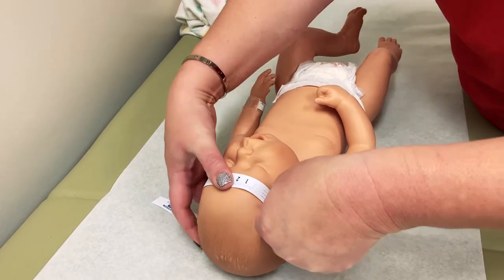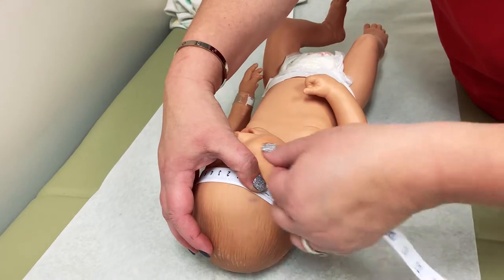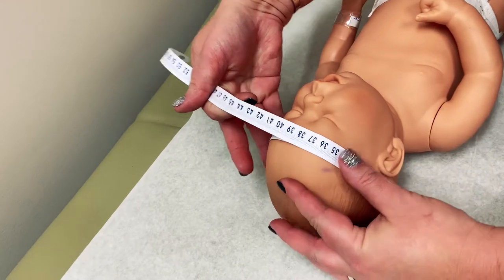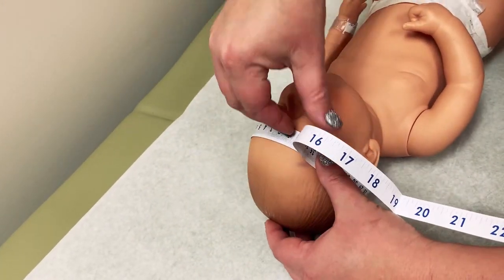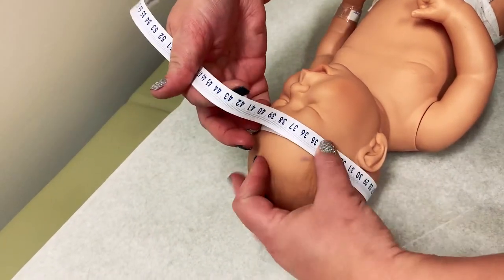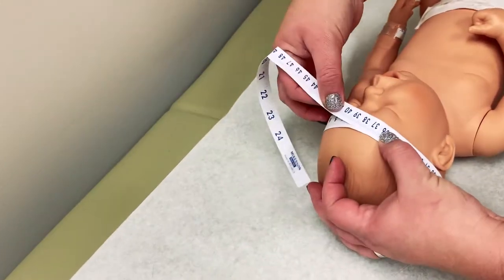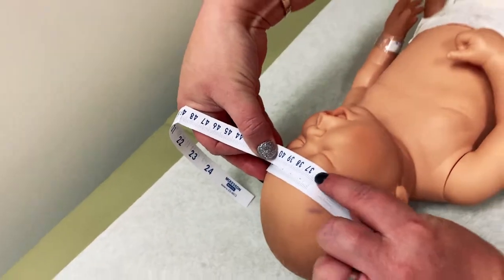So we're going to bring the band around, lay the little head back down, pull this up and around. We can see that this baby's head circumference is about 36 and a half centimeters.